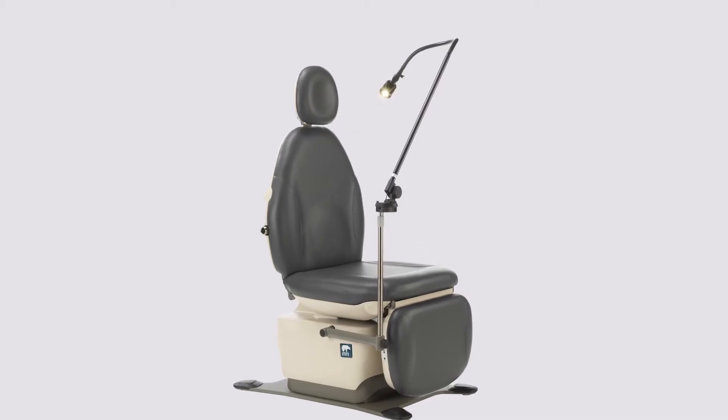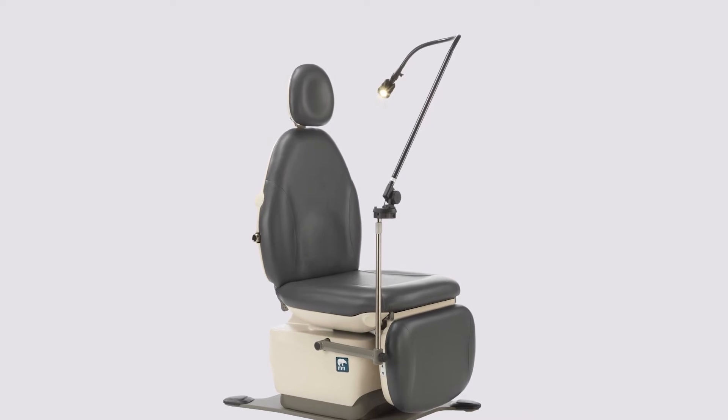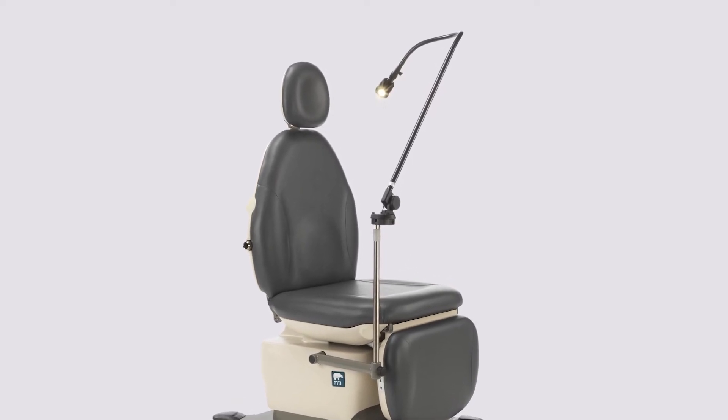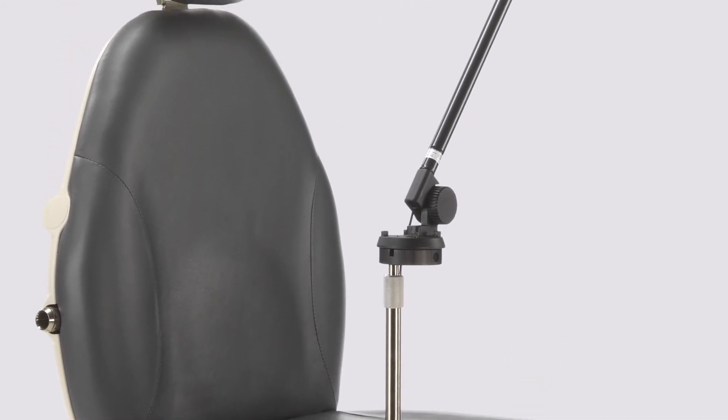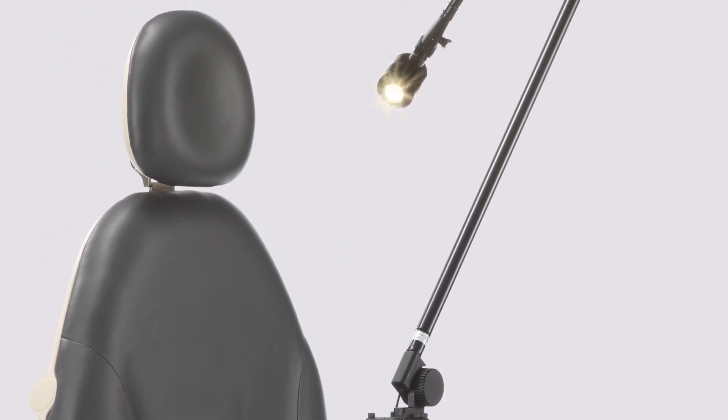Additionally, the Lumeris can also be installed on your MTI chair, providing versatility for examinations. The vertical adjustment coupled with the adjustable base and light head provides lighting on any part of your patient's body.